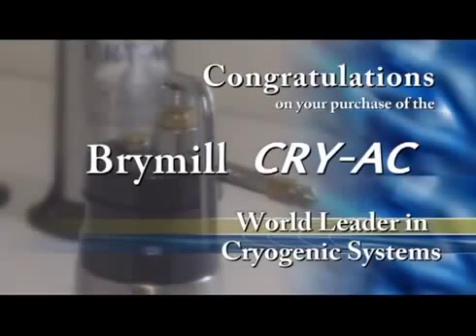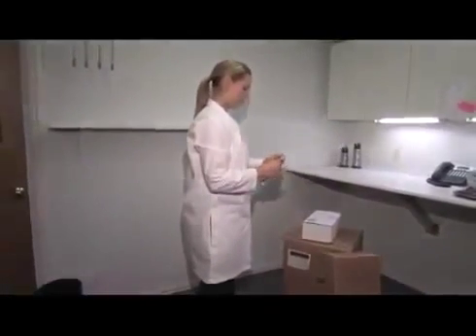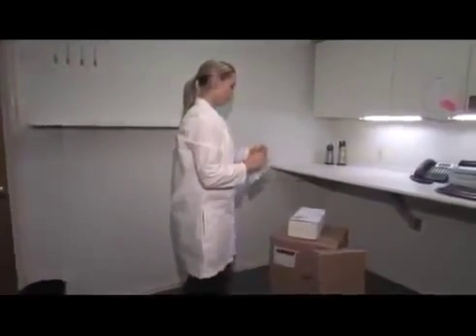Congratulations on your purchase of the Brymill CRY-AC, World Leader in Cryogenic Systems. Now that you've received your Brymill Cryosurgical Starter Package, let's go through some important information.